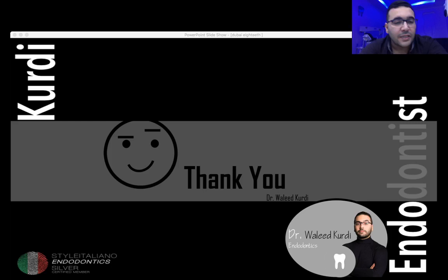I know that some people use oils, olive oils, and my great friend Yoshi Tsuchi uses olive oil, and he has great results. But I don't use it. I just use sodium hypochlorite. He uses it, and I think that he has great results. And you can use it, but for me, I just use sodium hypochlorite.